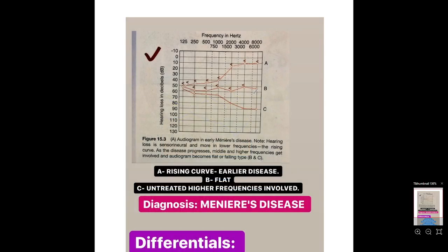Okay, this is for the Meniere's disease. As you can see, this is for the right ear, conduction. Okay, this is the bone conduction, and this is the sensory neural hearing loss, because in Meniere's disease there is always a sensory neural hearing loss. This is a rising curve, meaning the early disease. This is for the second, meaning it is flat.